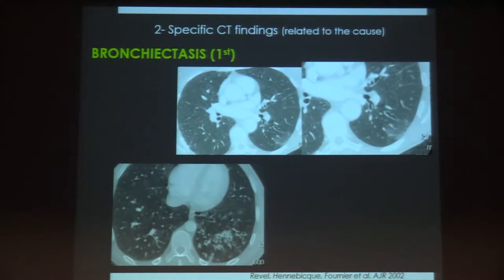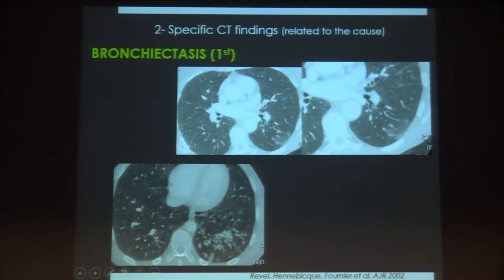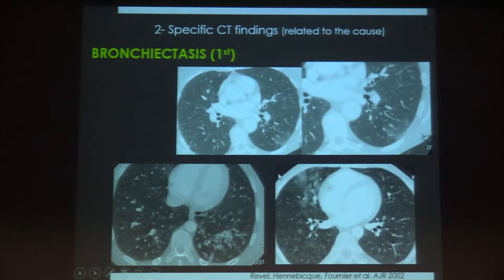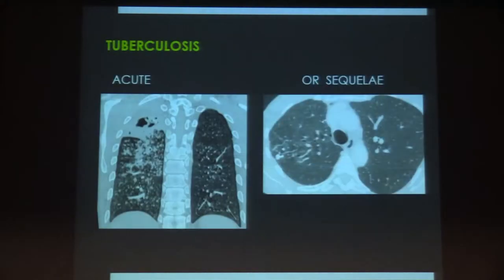The second category of CT findings are those related to the cause of bleeding. The first and most common cause of severe haemoptysis is bronchiectasis. Examples are shown here — a small amount of ground glass indicating the site, left lower lobe bronchiectasis, and another case with bronchiectasis in the middle lobe.